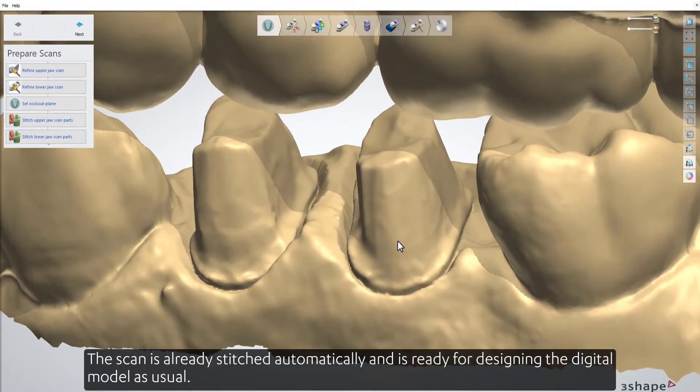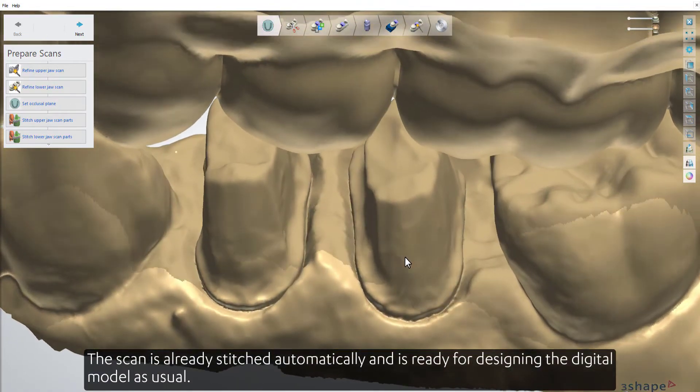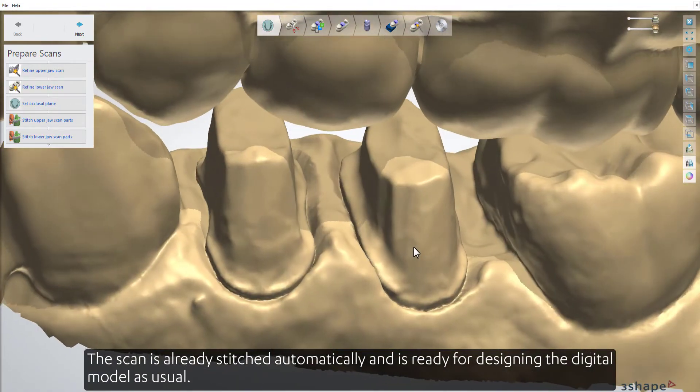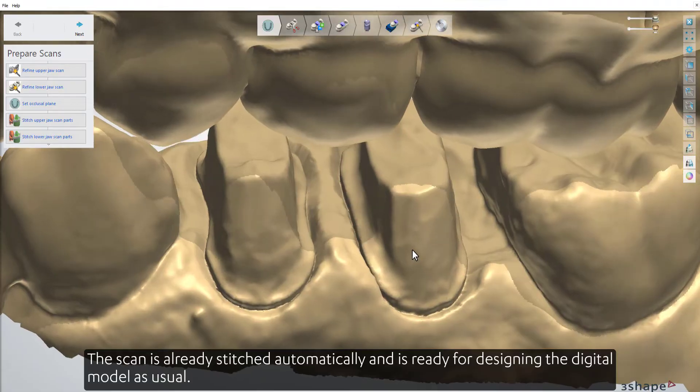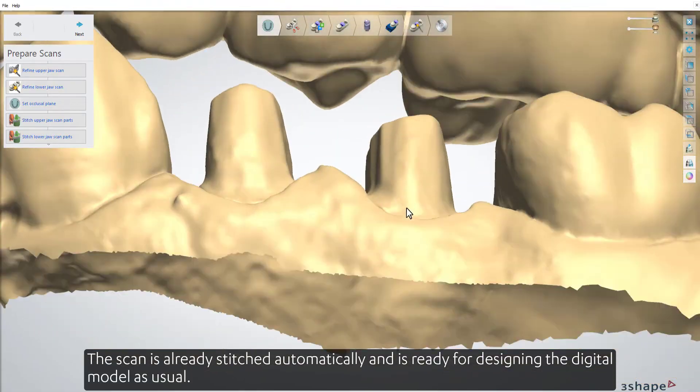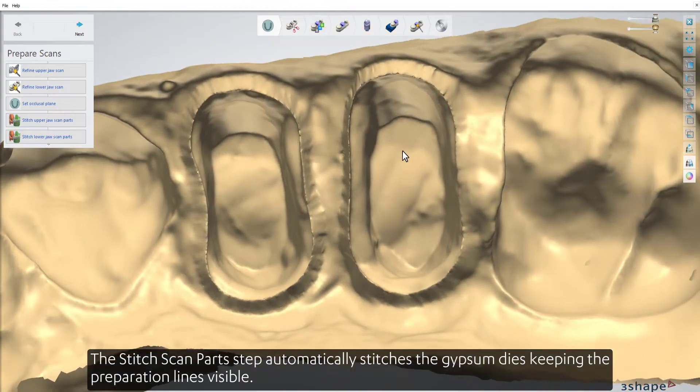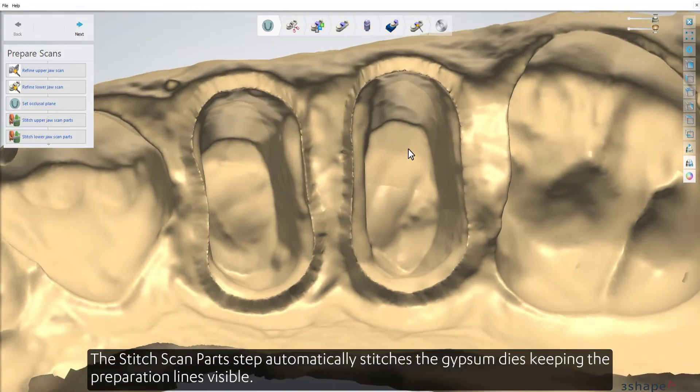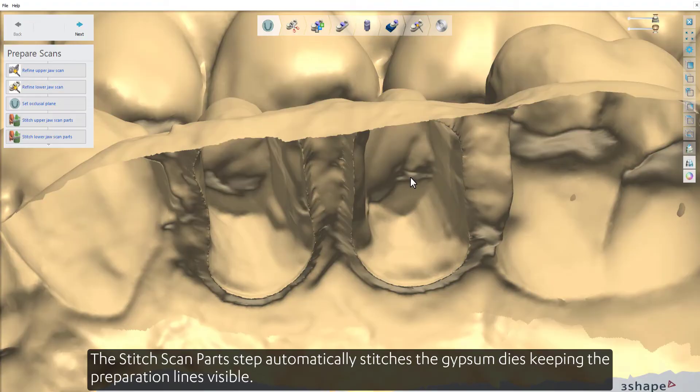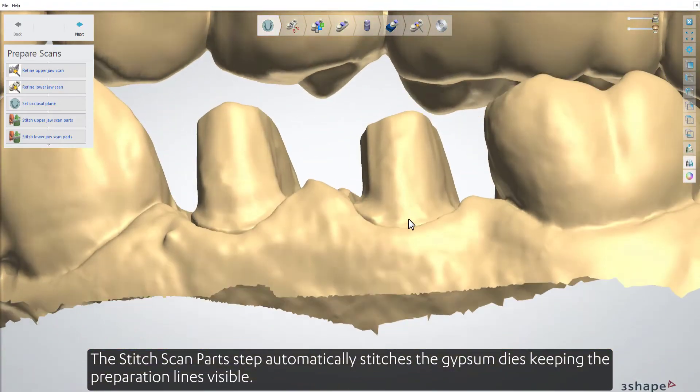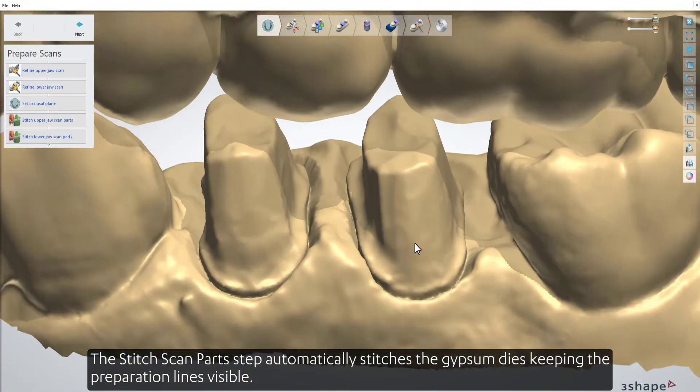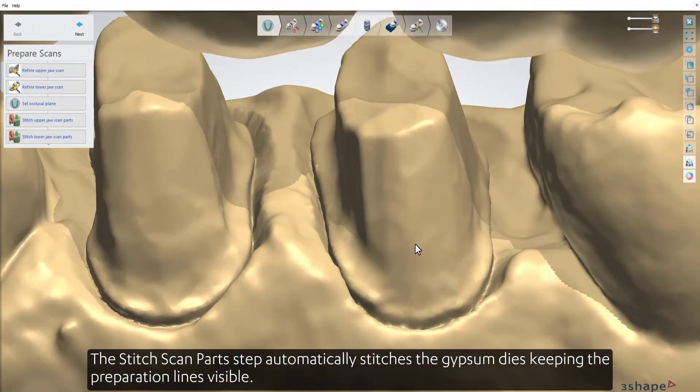The scan is already stitched automatically and is ready for designing the digital model as usual. The stitch scan parts step automatically stitches the gypsum dies, keeping the preparation lines visible.